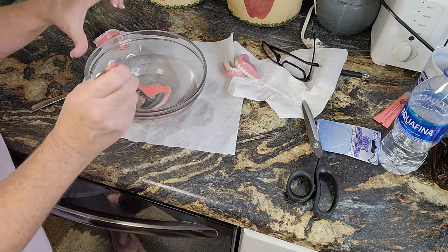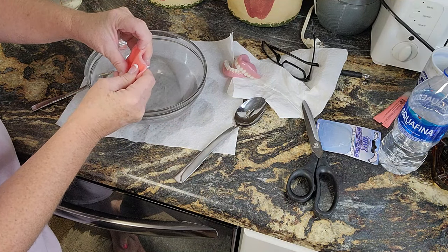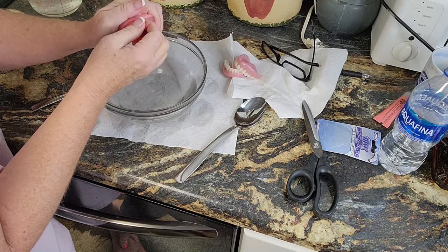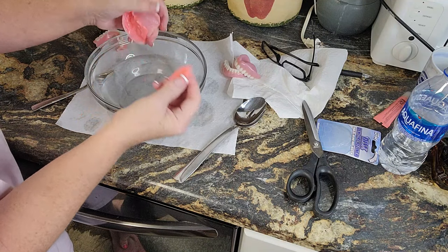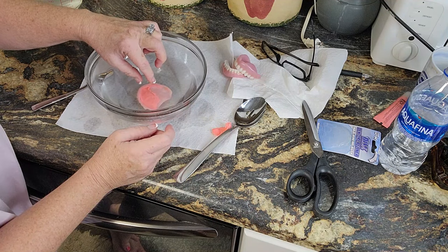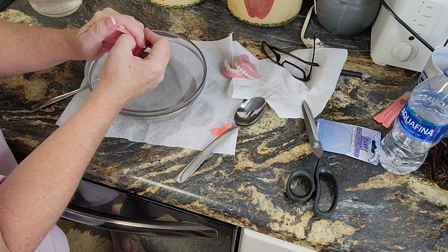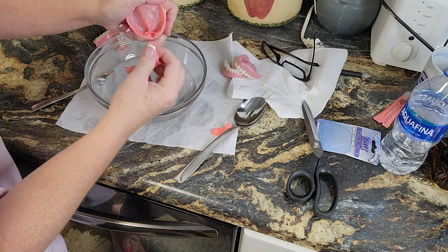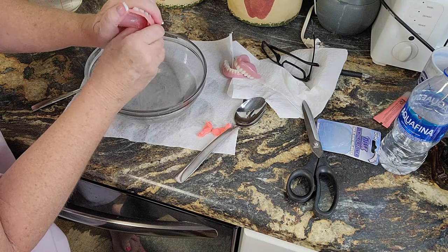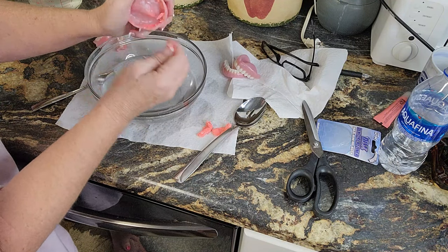Ouch. Because I know when you use cushion grip, you can't do that. Look. Okay, okay. Is this crazy or what? This is coming out. I don't know why you'd have to remold it unless it moved around, but this is about how the cushion grip comes out. Probably if I used a toothpick or something, it'd come out easier.